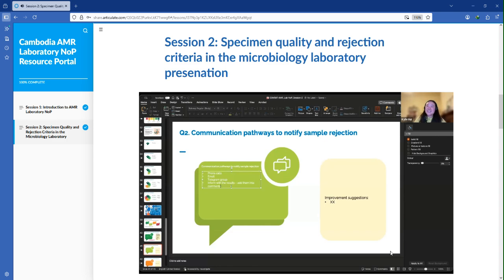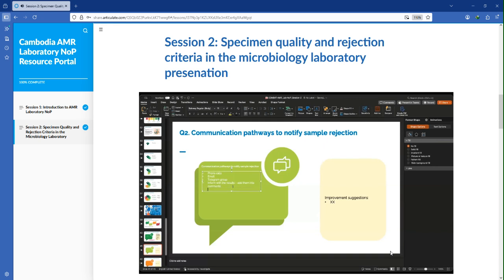Another thought is that what was just said is probably very applicable for the sputum culture, where we have to list down what we saw in the gram stain. Yeah, I think what was suggested is actually quite good for all sample types.